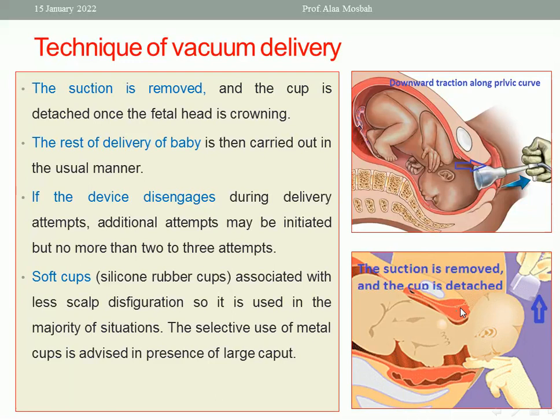Okay, when the fetal head is crowning, the suction is removed and the cup is detached. As in this picture, suction is removed and the cup is detached because crowning happened, and the head will be delivered and the body as usual.